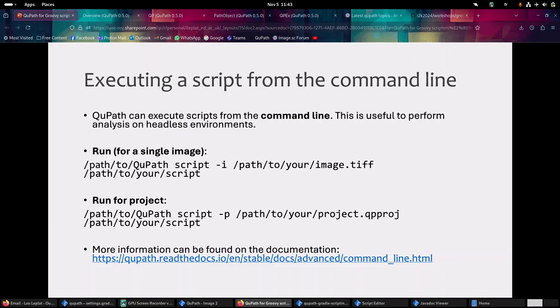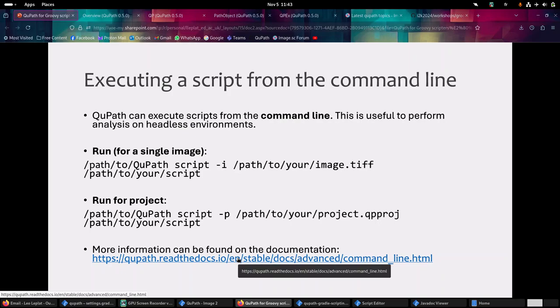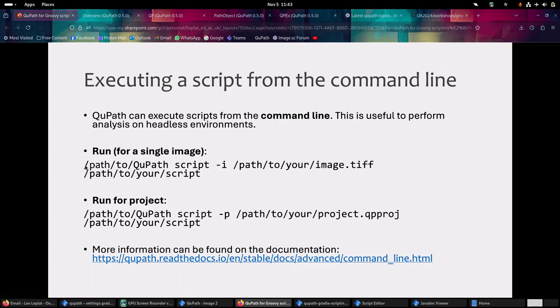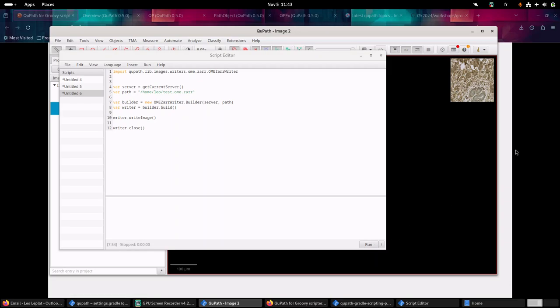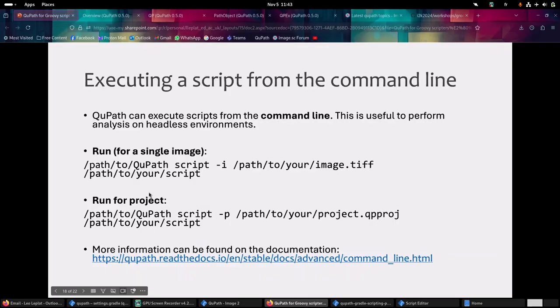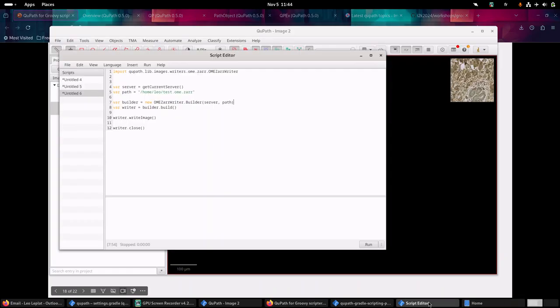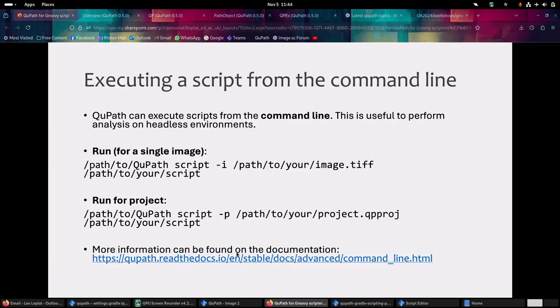I want to mention that you can execute a script from the command line. Basically, you specify the path to your QuPath executable, then write script. If you want to run a script on a single image, you specify the -i parameter and give the path to your image, then specify the path to your script - this is equivalent to clicking Run. But if you want to run a script on different images of a project, you don't use -i but -p, and then specify the path to your .qpproj file within your project - this is equivalent to clicking Run for Project. You can find more information in the documentation.